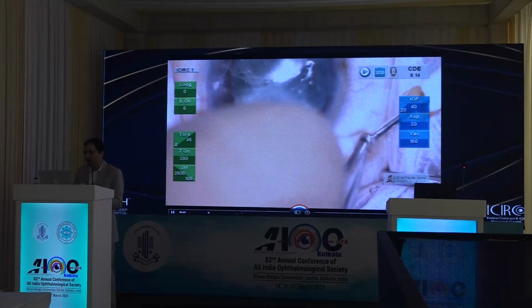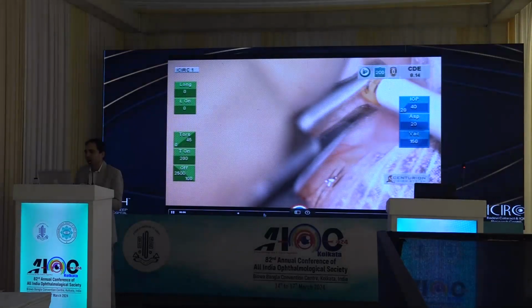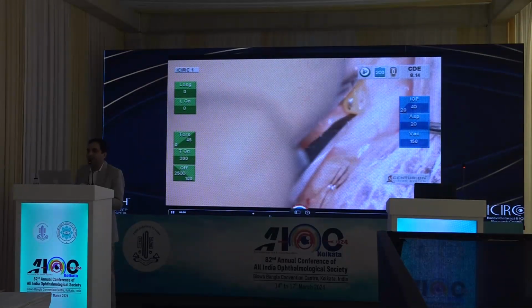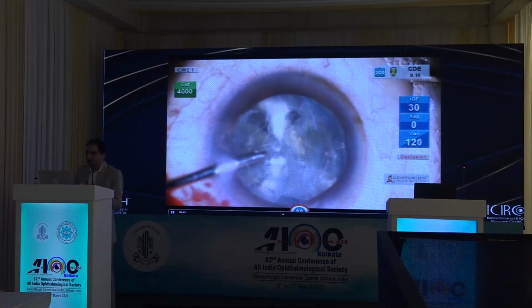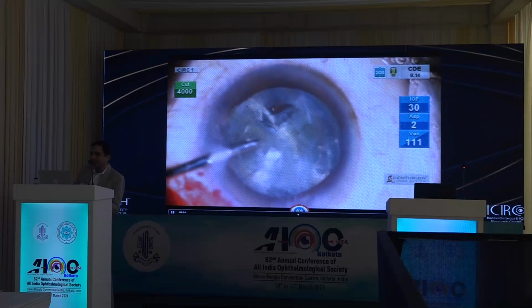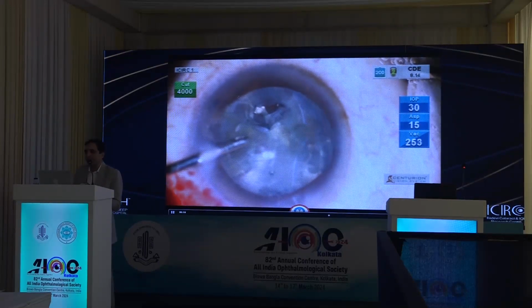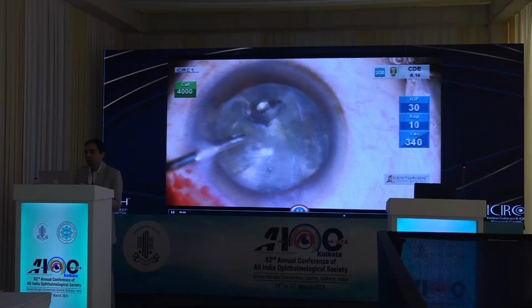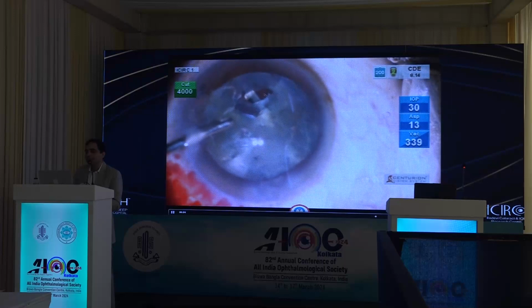And therefore, we need to tackle it before I look to tackle the rest of the 3/4 of the nucleus. A good anesthetist will always help. They may bump up the... and look at this, the pars plana drained nicely. That vitreous that was there got sucked in beautifully through this PCR without causing even a millimeter of turbulence in the area of the PCR.